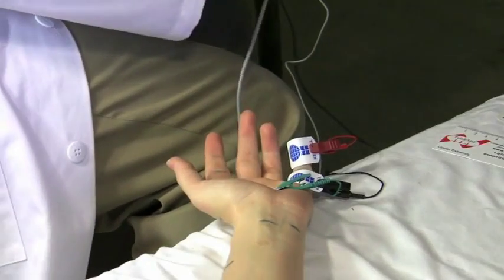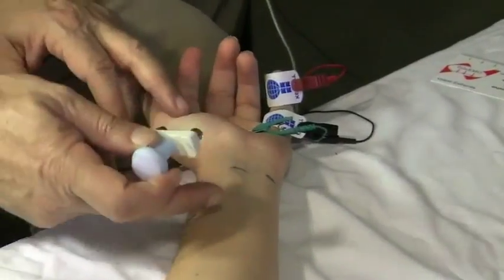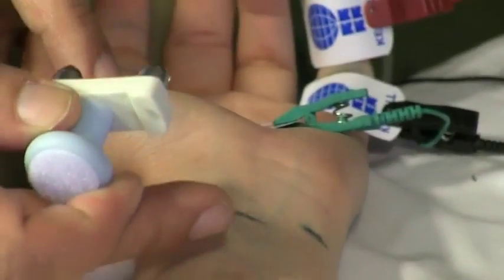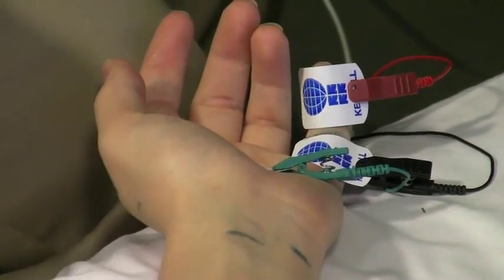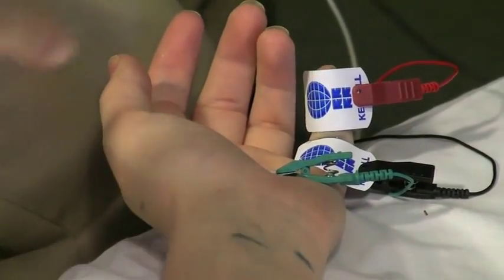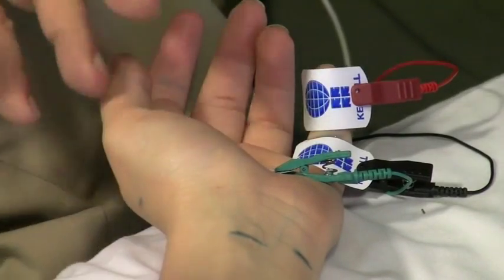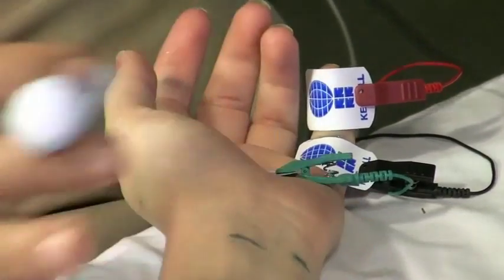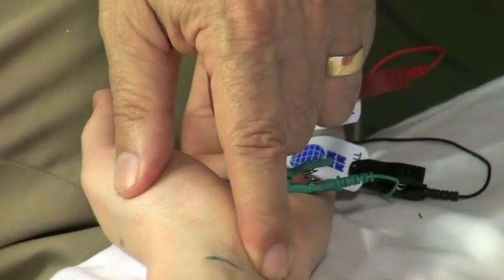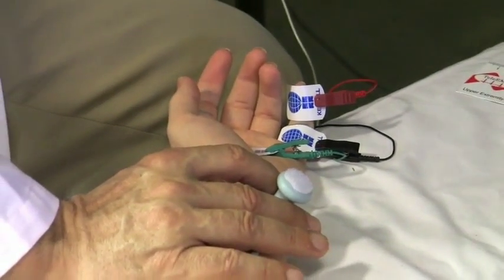Now, I put a little bit more cream. Don't put too much cream, because sometimes you make a cream bridge. That means there's cream between this electrode and this electrode, and you're going to short circuit. Nothing's going to happen to the patient, but you're going to short circuit the signal. You're not going to get a good response. So be very careful on how much cream. Not too much and not too little, obviously. I stimulate the ulnar nerve over this area of the wrist right here. Okay, and now I got to go back again here.